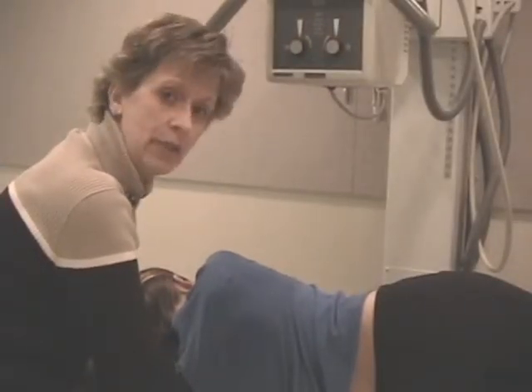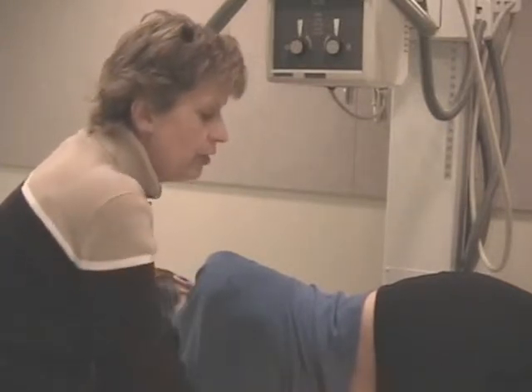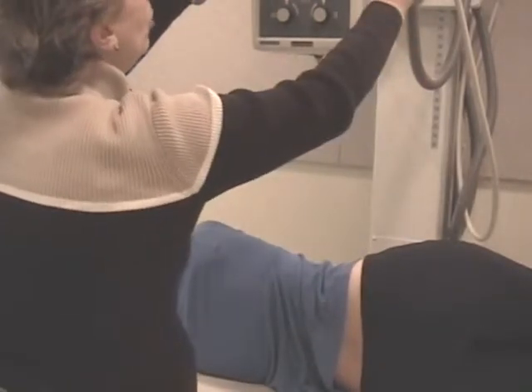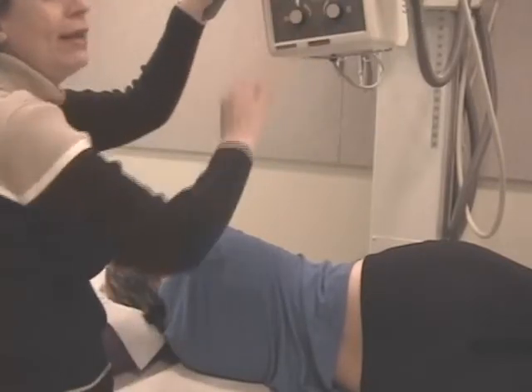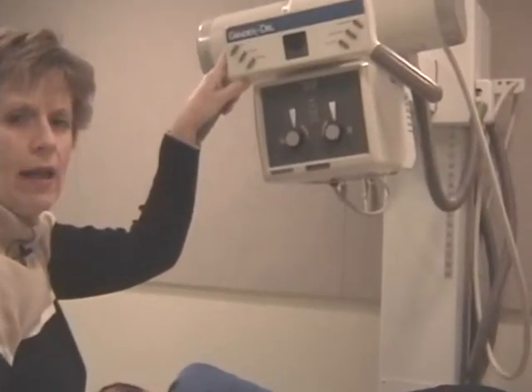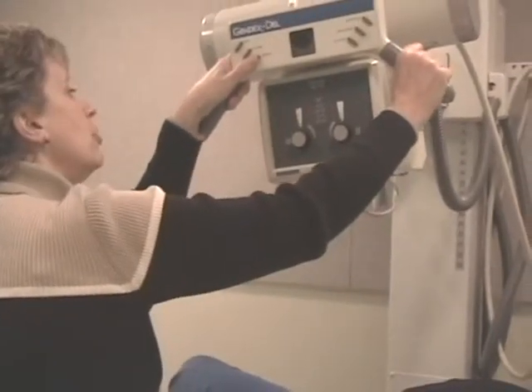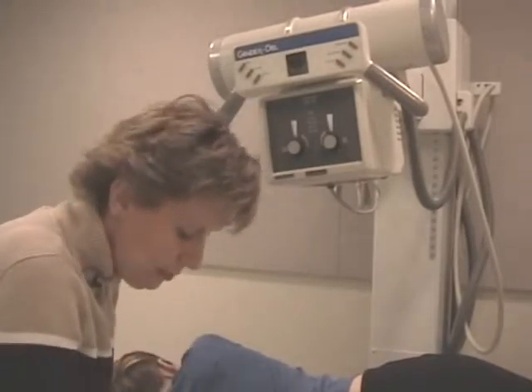Well, Drea, when I analyzed her spine earlier in the procedure, I did notice that in the L5-S1 region, we would need to have a slight caudal tube angle. So that's what I'm going to do now. We're going to angle the tube 5 degrees with Drea, not 8 because she did not curve very much. Somebody who has wide pelvis, we would have to angle the tube more like 8 degrees. Okay, so I have a caudal angle. I'm going to drop the tube down the 1 inch for that 5 degrees. I'm going to change cassettes to my 8 by 10.